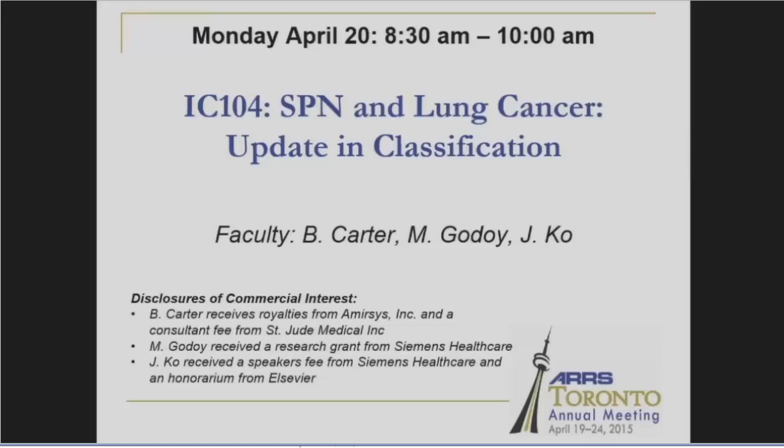So I just want to bring it to the attention of the audience that four of us were sued for a 4 to 5 millimeter solid central nodule right next to a vessel. And it was not perceived by four different radiologists on three different CTs that were done over two years. Then the patient came in with chest pain a little bit later, and had a CTA for PE, and it showed up on the coronal. So we went the whole route.